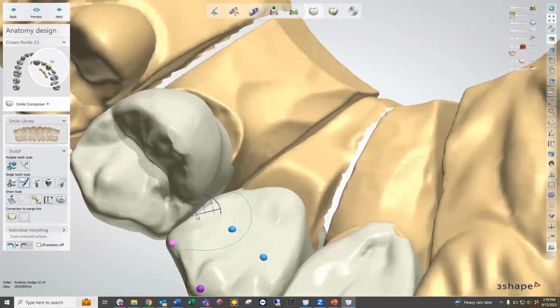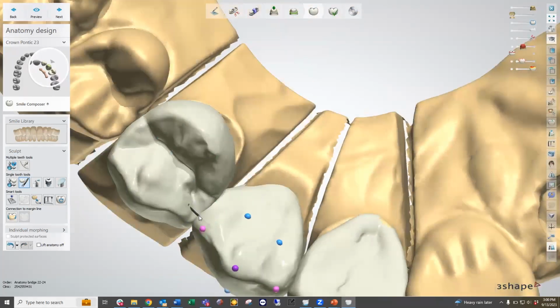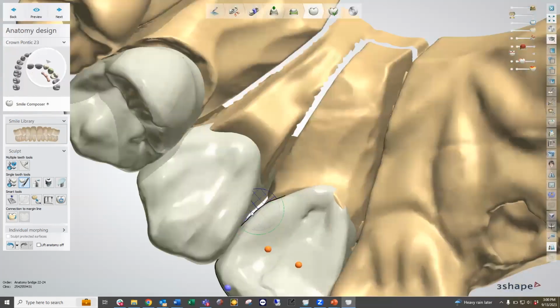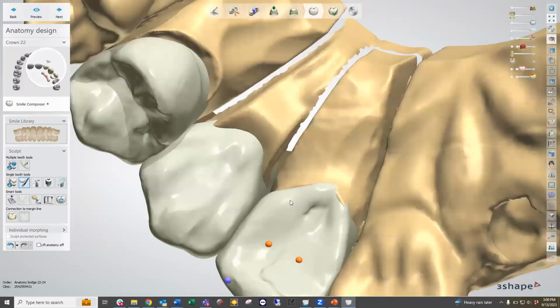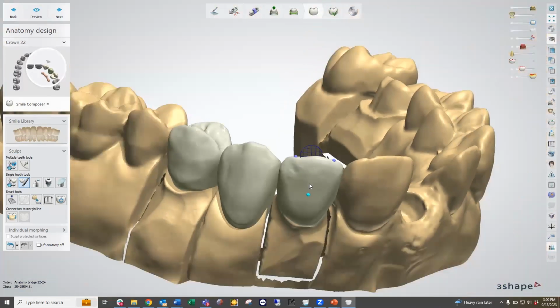I build out this area. I might build out this area on the cuspid. Again, making sure that we're not building up too much in this area, and removing all sorts of food traps that I just created in my design over here. And then I'm going to go ahead and attach them to the margin line.